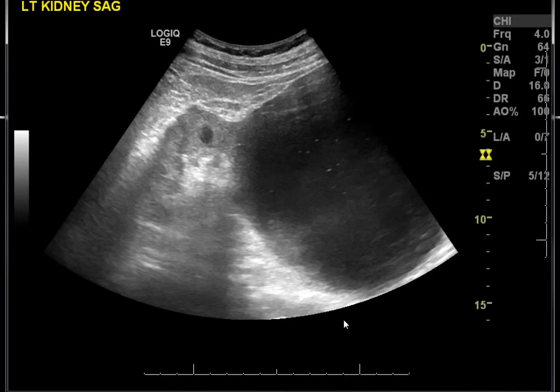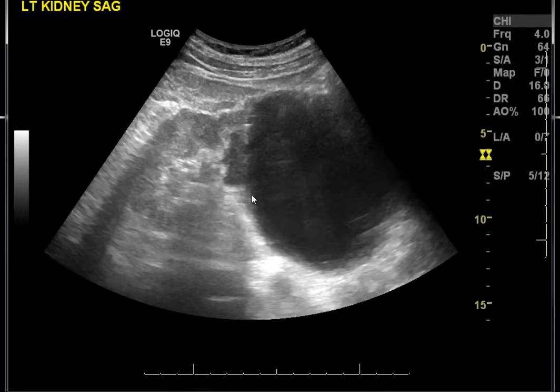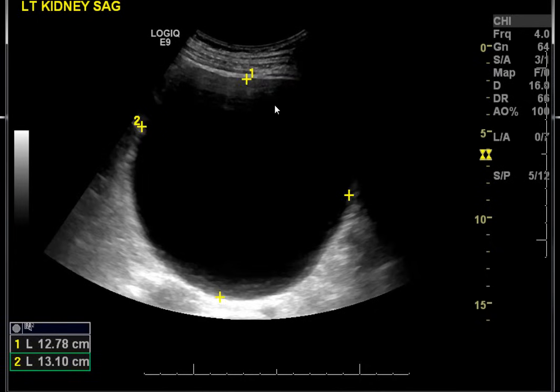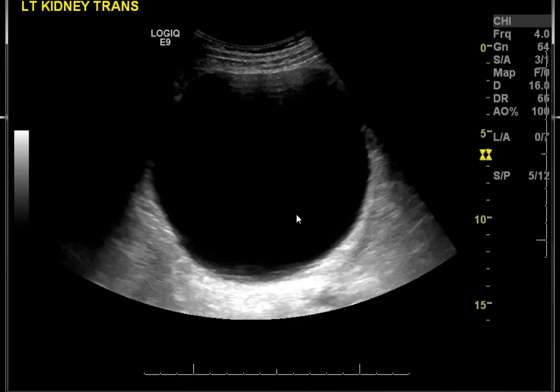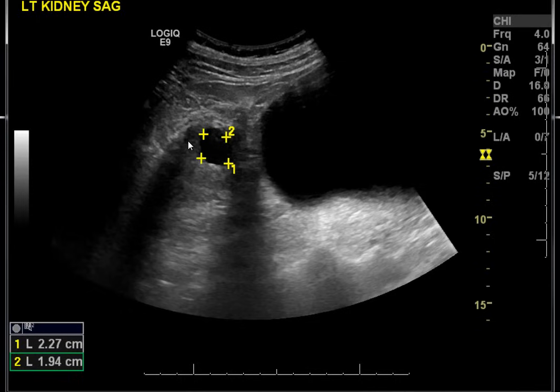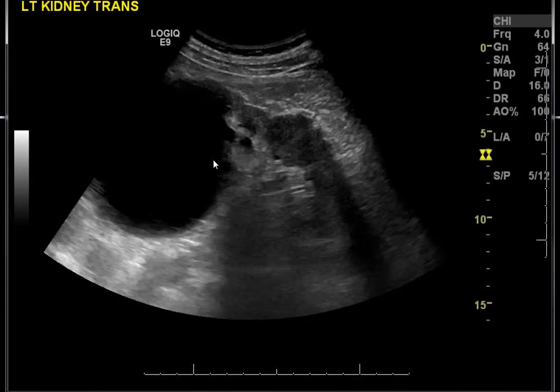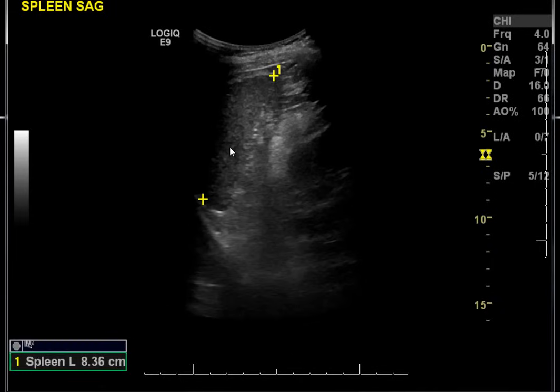There is a huge cystic structure related to the lower pole of the left kidney, measuring 12.7 by 13 centimeters. Always look at the back wall — acoustic enhancement indicates a poor attenuator. Always describe the wall. That's a huge renal cyst off the left kidney. There are also another renal cyst and another renal cyst, and there is the spleen.